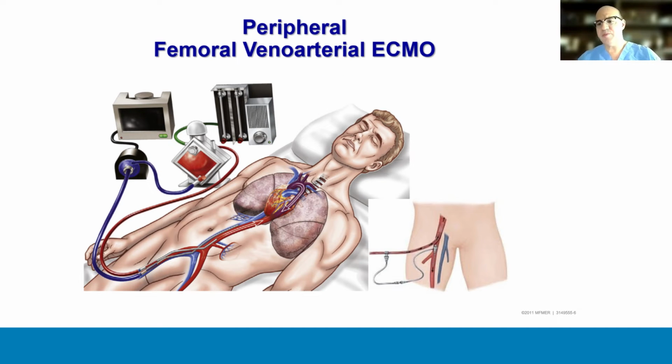Now, let's move on to venoarterial ECMO. Let's say you come off, there's poor ventricular function, it was a high-risk cardiac operation, or there was an intracardiac misadventure, or something like that. There are, again, several different configurations. However, this gets a little trickier. So if you're really interested in closing the chest, there is peripheral cannulation potential, where you have the femoral artery and the femoral vein. So the femoral vein being the venous outflow, and the inflow being the femoral artery.